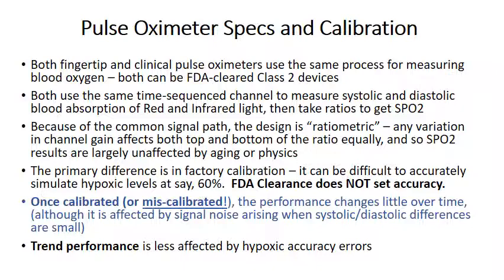The way that the pulse oximeter ignores venous blood and concentrates on arterial blood is by looking for changes in transmission of light, representing systolic and diastolic levels. So venous blood does not pulse, it does not change, it is ignored. It is basically removed by DC or high-pass filtering.